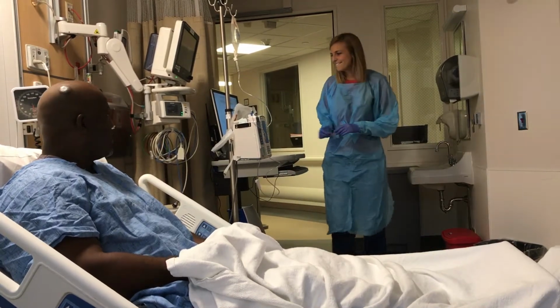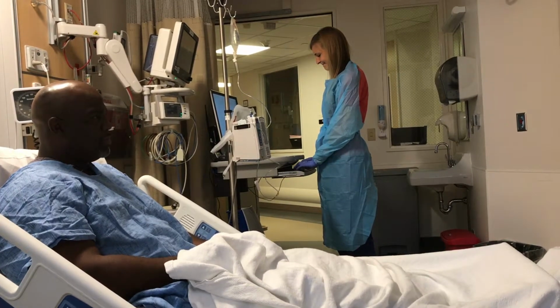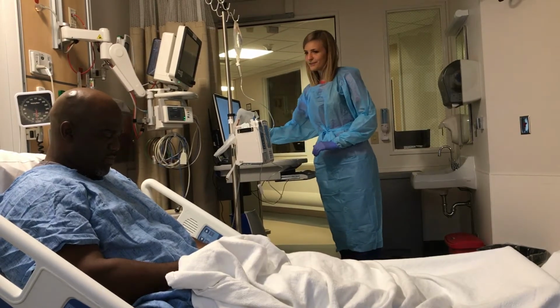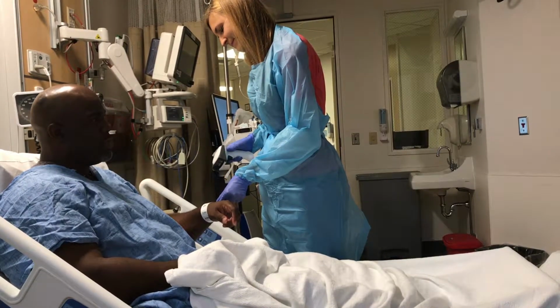You doing okay? I'm good. How are you? I'm good. Are you in any pain? Have a little bit. Got a headache. Go ahead and scan you. What's your name and birthday? Mr. Holiday. Birthday is 1/1/2000.